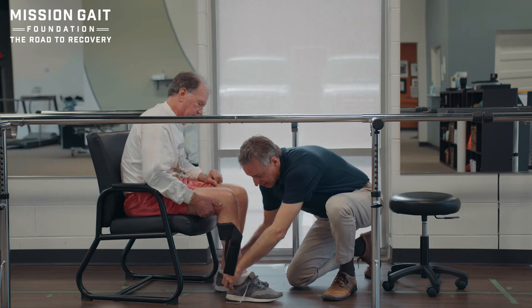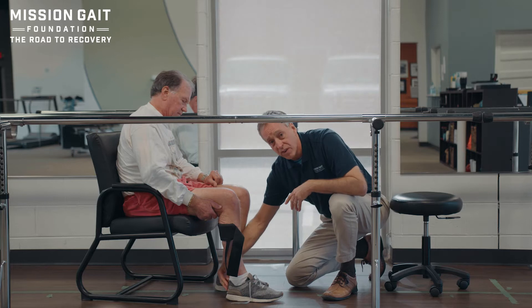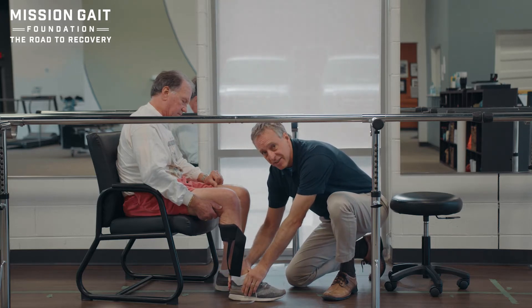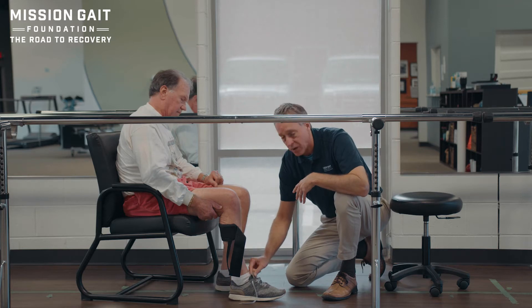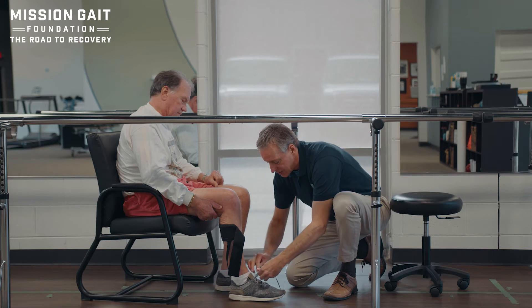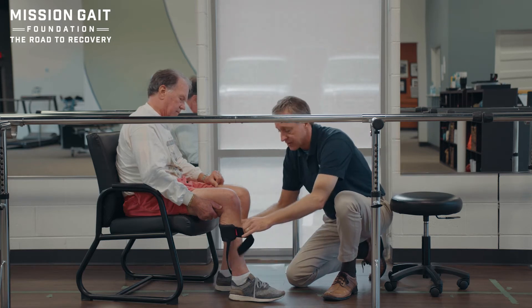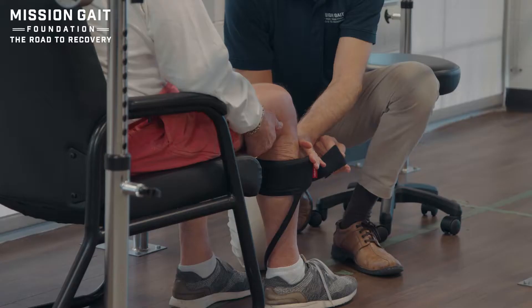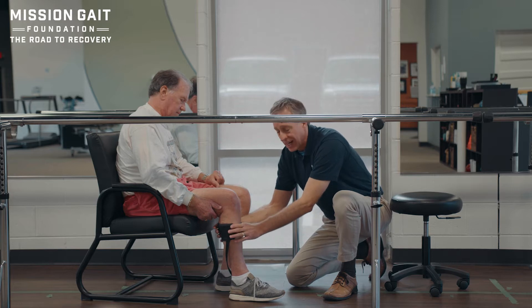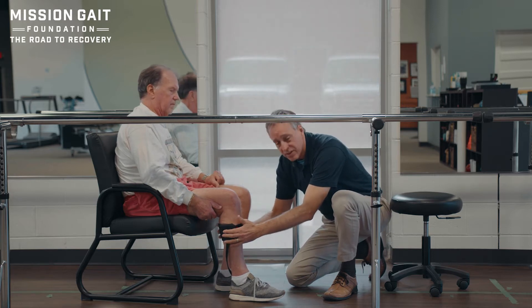This is a bit of a softer shoe, which means the back strap is going to fold over a lot easier - a little bit harder to don, but what this patient likes. Once it's there, I'm simply going to take up the slack. I don't want to make the shoe super tight, just take up the slack. As far as the Velcro closure, I want to pinch the brace a little bit at the top, just to take up the slack and wrap it around. I don't want to cinch it like a tourniquet, but I do want a good snug fit.